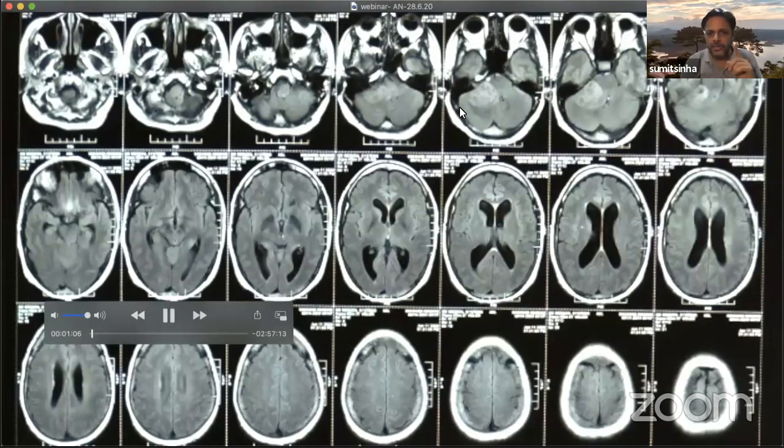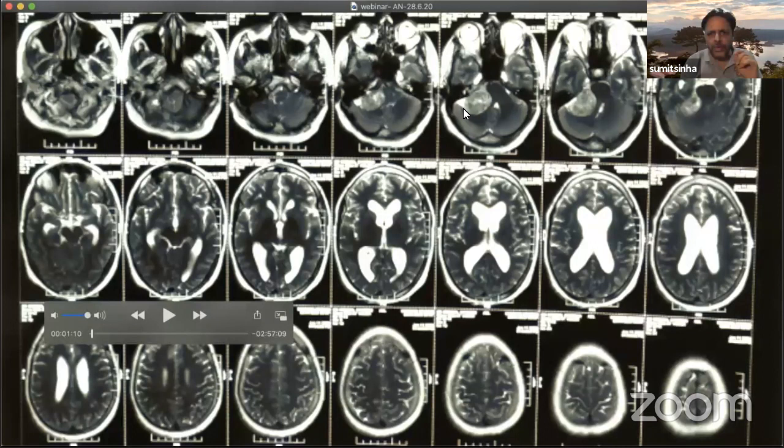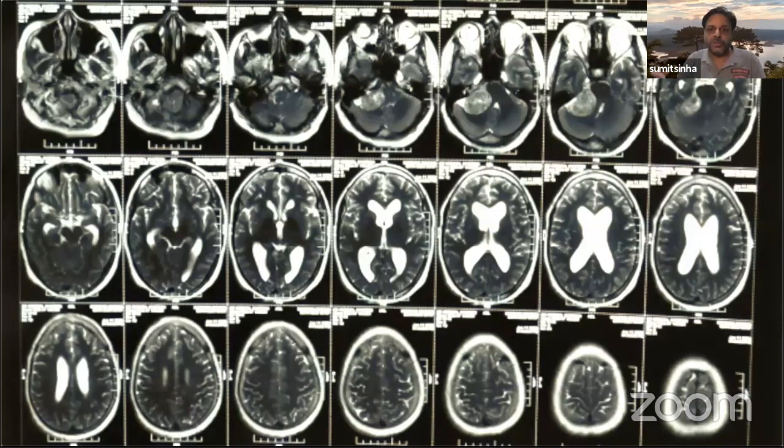In this patient, you see that there is a CSF cleft, which is well seen at some places and not seen at other places. So this gives you a fairly clear idea of how much difficulty you are going to encounter during the surgical dissection of this tumor from the adjacent brain structures. Of course, if you see a clear CSF cleft around all the tumor, then your chances of having a clean dissection are greater compared to when there is an absence of any CSF cleft.